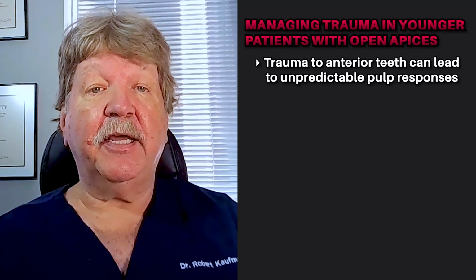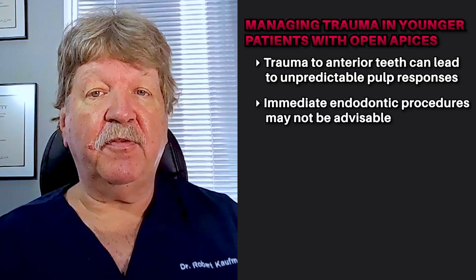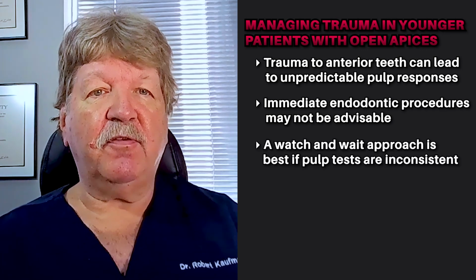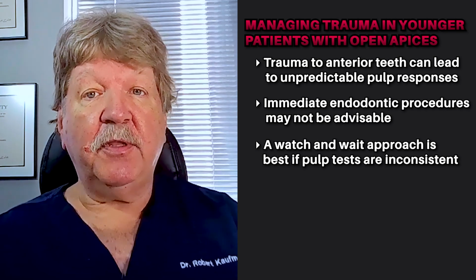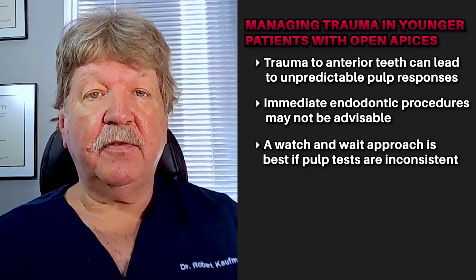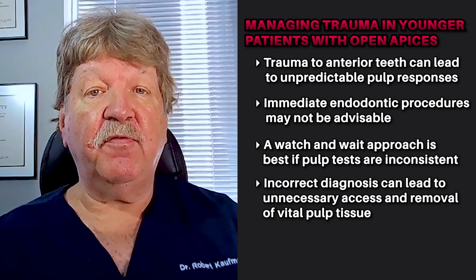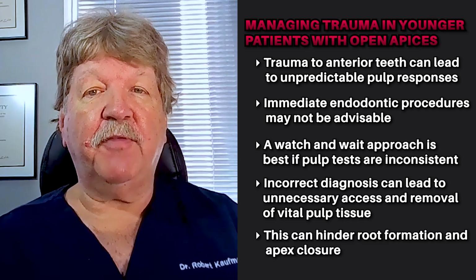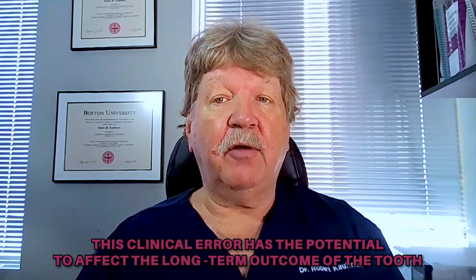Younger patients with open apices who undergo trauma of anterior teeth can have unpredictable pulp responses immediately after the trauma. Rather than risk doing endodontic procedures immediately, it's sometimes best to have a watch and wait attitude if the pulp tests don't produce consistent or expected responses. If an incompletely developed traumatized anterior tooth is incorrectly diagnosed with this, the clinician may incorrectly access the tooth and risk removing vital pulp tissue, which is necessary for further formation of the root and closure of the apex. This clinical error has the potential to affect the long-term outcome of the tooth.